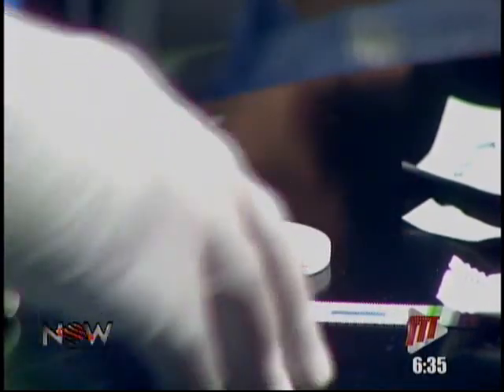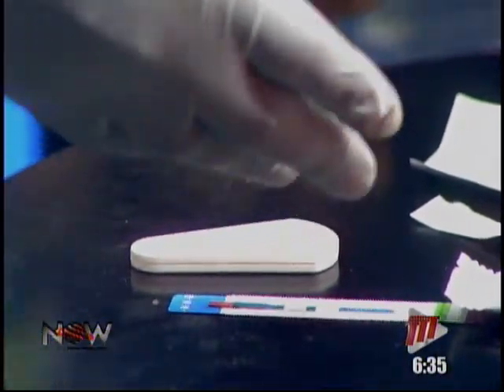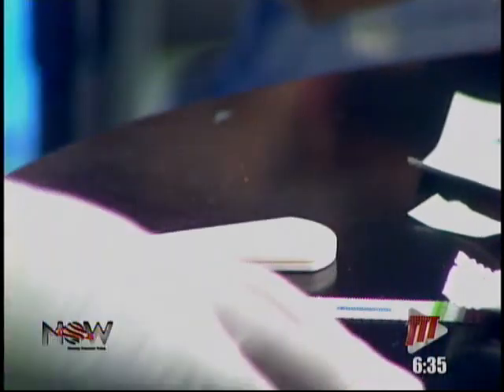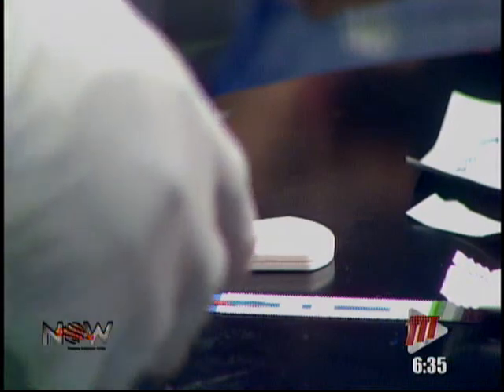When it passes over the antigen, it attaches itself onto the HIV antibodies. And when the test is complete, we will get the results. If it is positive, there will be 2 stripes. If it is negative, there will be 1 stripe. If there's no stripe, it means the test did not work properly, and we will have to do a repeat.